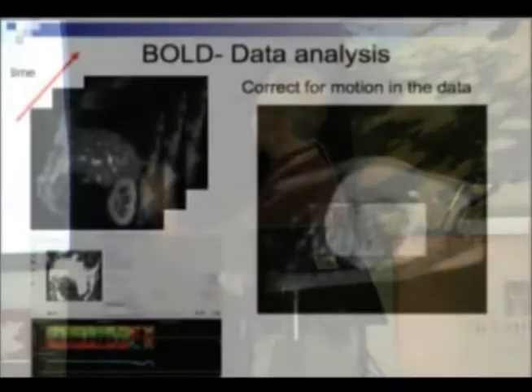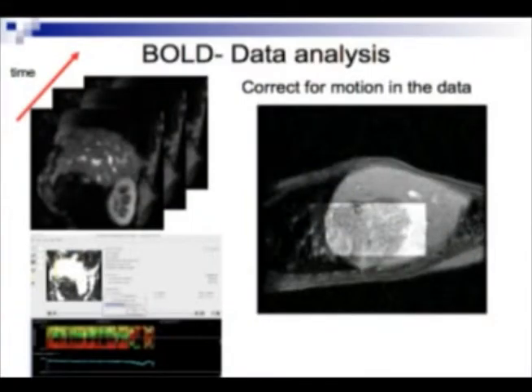It works great. Motion, again, is a problem. We use the same pattern matching algorithm. So there's a tumor right here. It's a hemangioblastoma. And no problem. I've just sped that movie up. We can track the motion, extract the data, all real-time breathing, no breath holding needed at all.